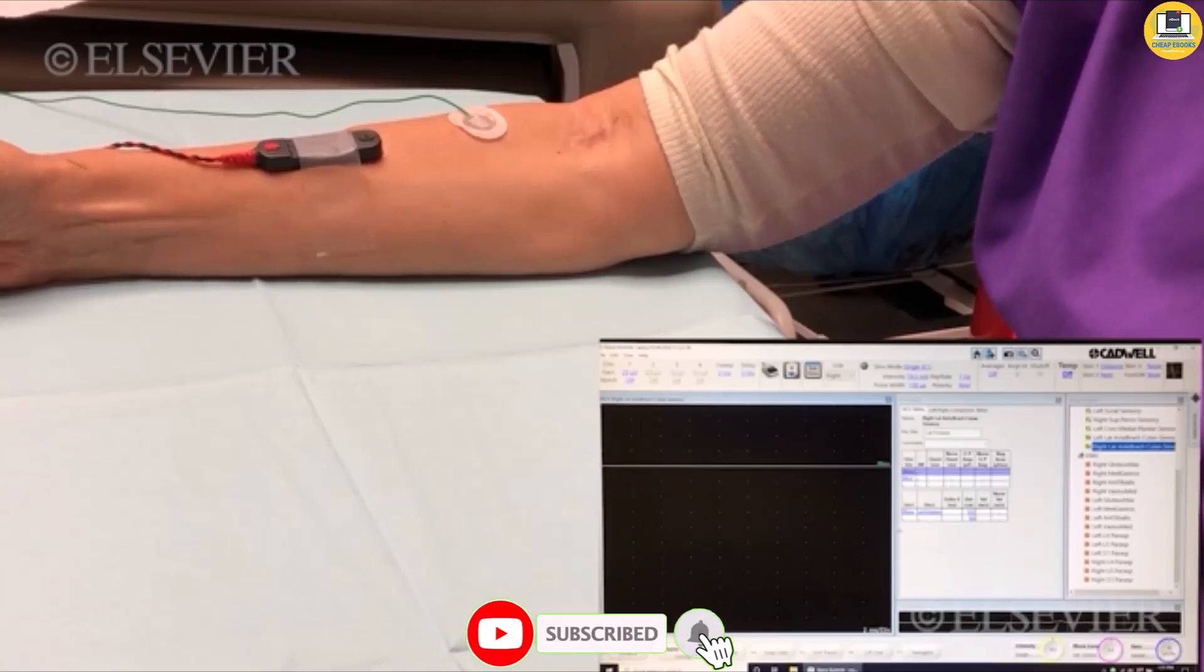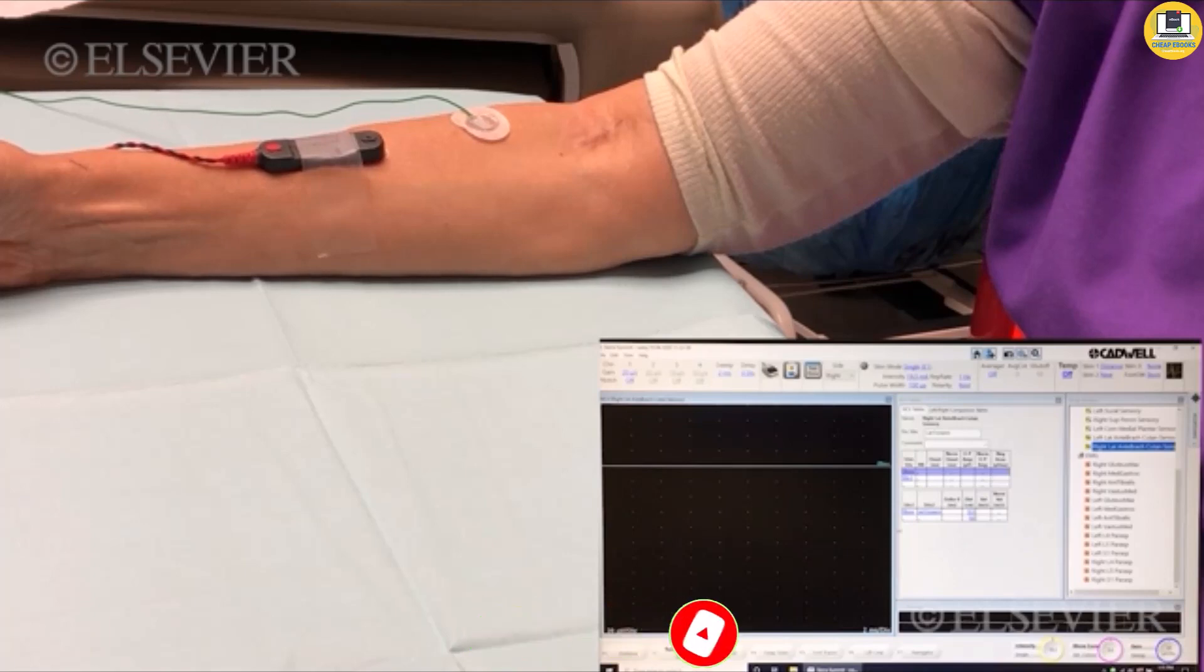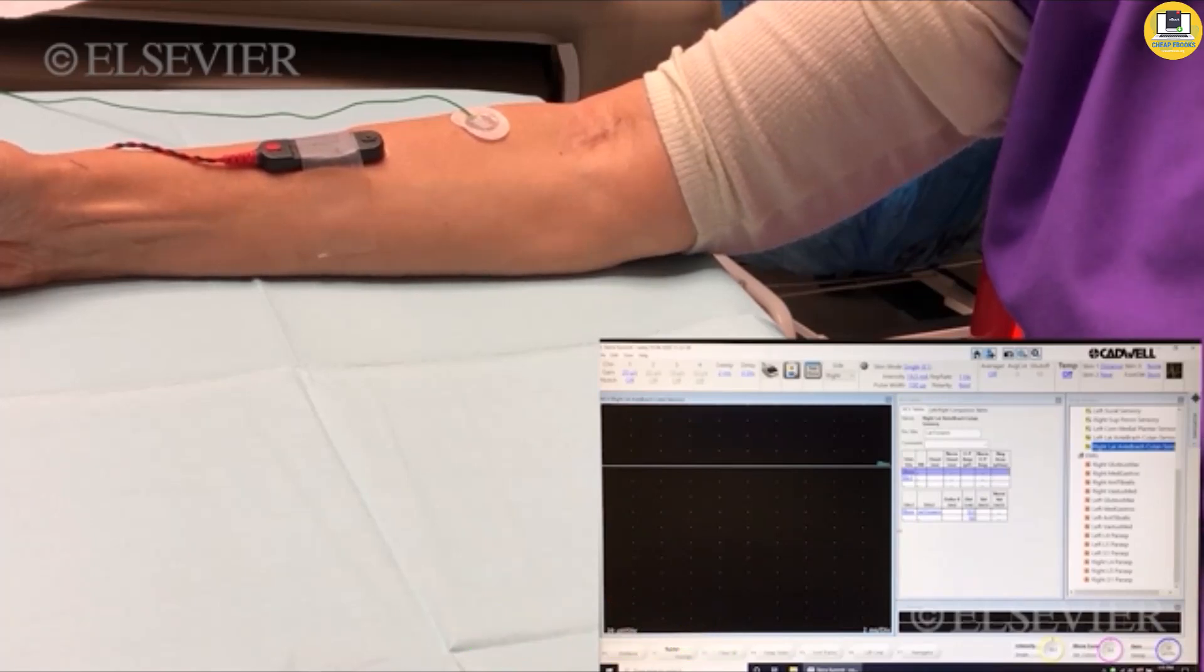Lateral anti-brachial cutaneous nerve studies. These studies can be useful in evaluating brachial plexopathies including lesions of the lateral cord, the musculocutaneous nerve, or the upper trunk.